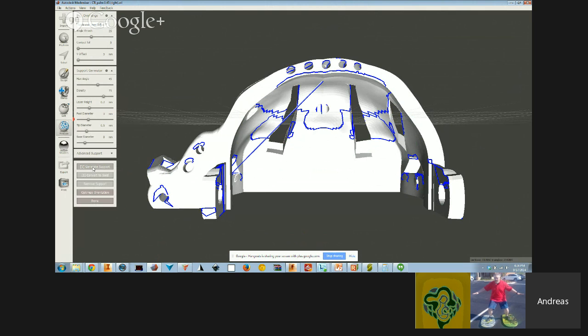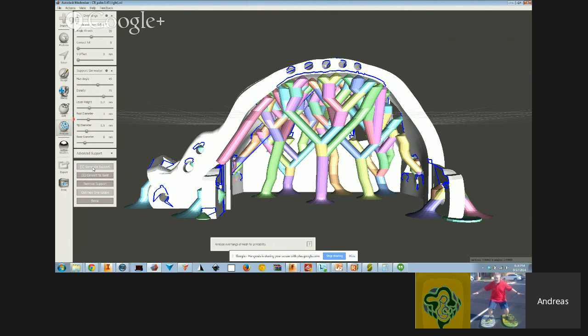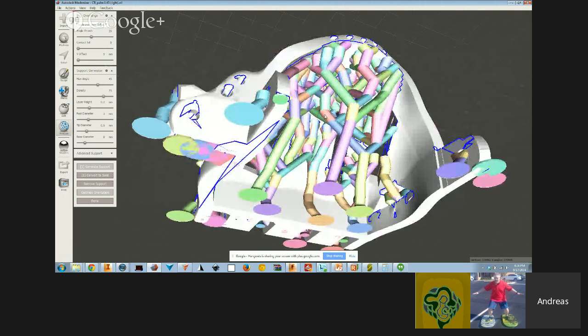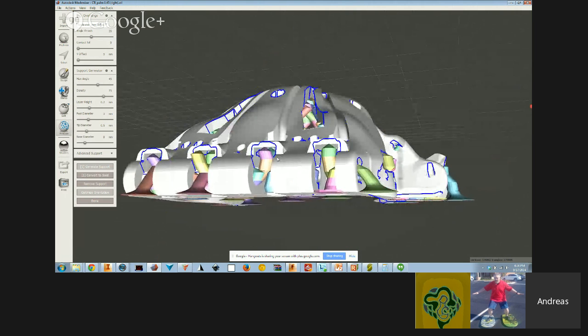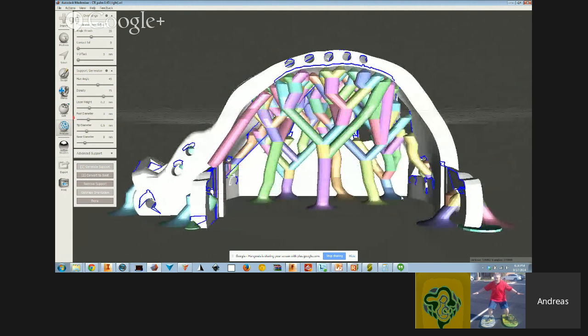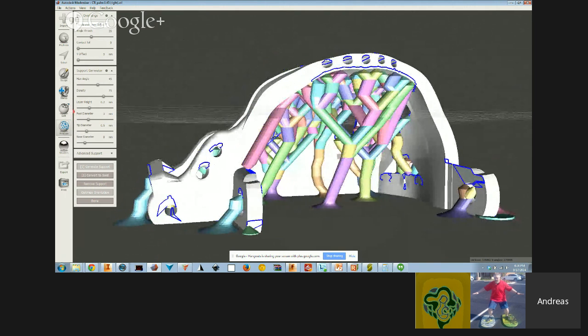So what I do to get the supports is just click Generate Support, and it does its calculation of knowing where that overhang is and where to put things. It does some basic tree structure, as you'll see here shortly. And there's my support that is generated. And you can see it's filling in where it considers the overhang to be, right? So in this case, I get a lot of little stuff here that I might not want. In some cases, this could be a hassle for printing. I mean, maybe this gets in the way.